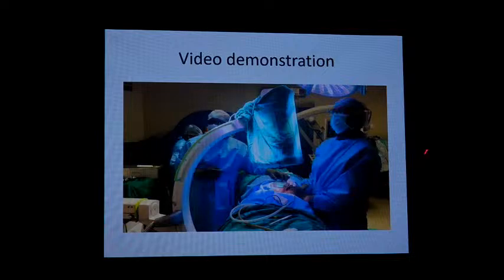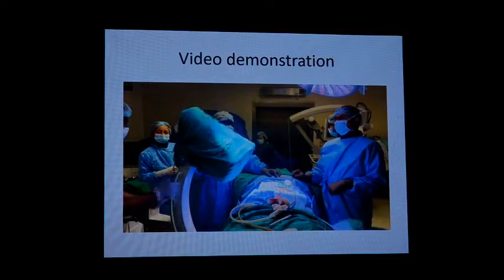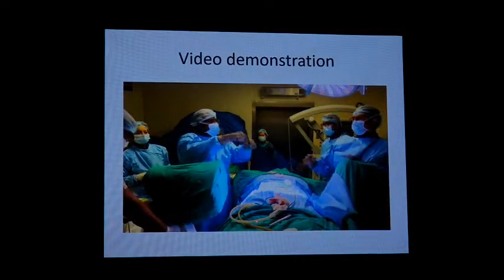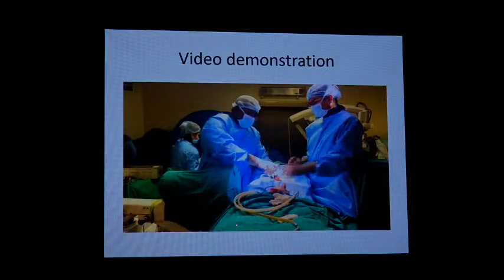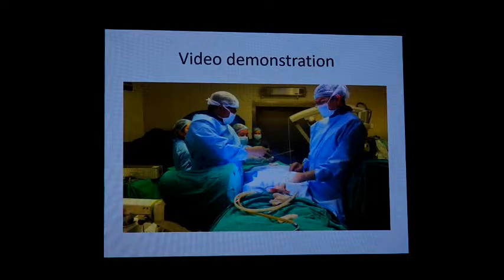It's always important to place your incision on the transverse process so that we are lateral to the pedicle. Then take your AP shot, and we have confirmed that it is good. Then insert your K wire.